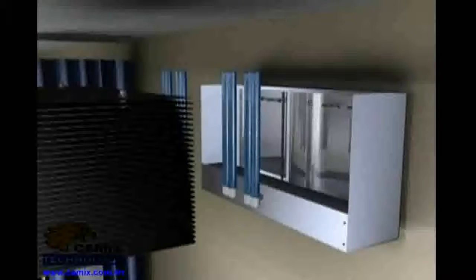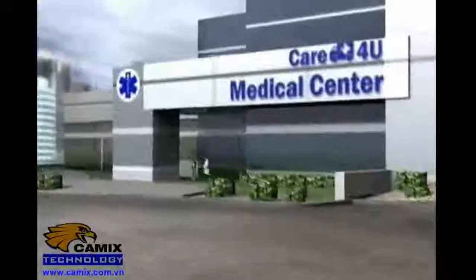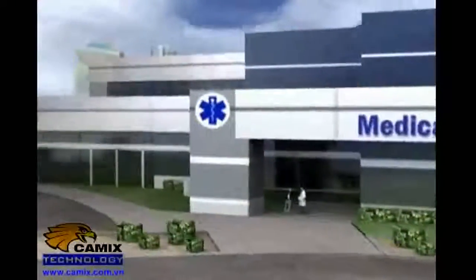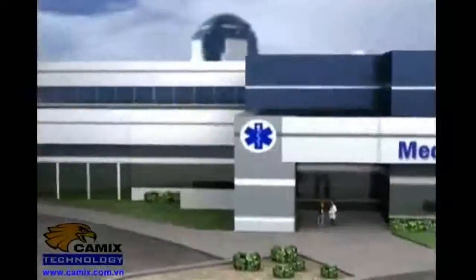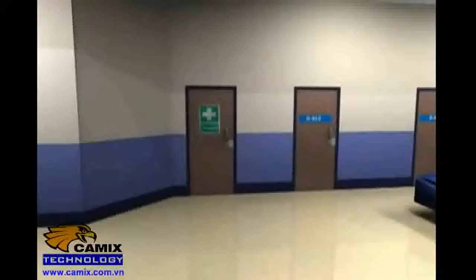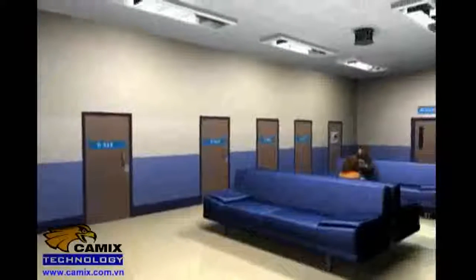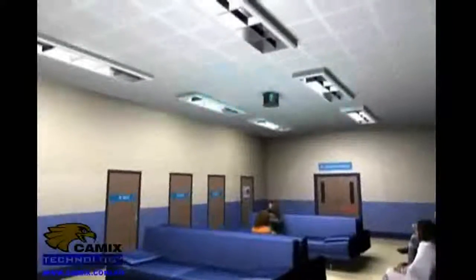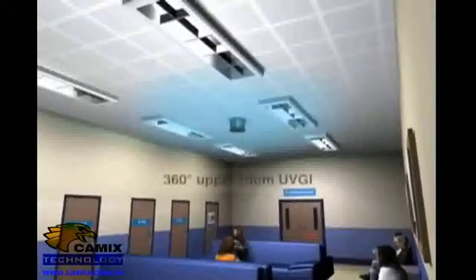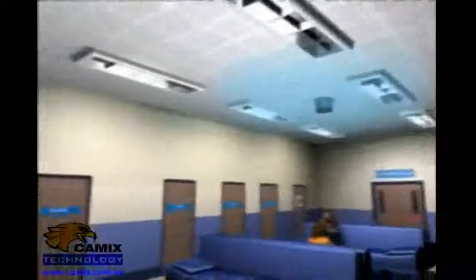When looking for places where these lamps could be efficiently applied, the choice for a hospital will be very understandable. There are a lot of people coming together, and the chance that some bear harmful bacteria and viruses is very big. This carries great risk, because many occupants in hospitals have a suppressed immune system. As well as patient wards, there are more spaces with an increased risk of bacteria and virus contamination, like waiting rooms, reception counters, appointment counters, first aid rooms, etc. The upper air system can successfully be applied in these places.